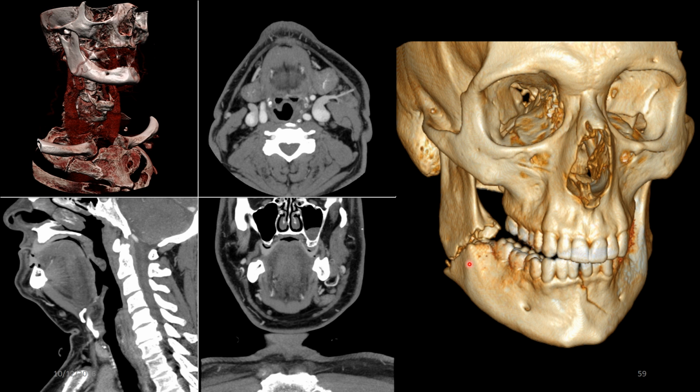And then usually when you fracture your mandible, it fractures in two places. So we've got a quite obvious fracture through there and a fracture that doesn't completely extend all the way through just here. These are just some CT scans of your neck. And then they've reconstructed these scans in the axial plane. That's not reconstructed. You've got the sagittal plane and the coronal plane. But I wouldn't worry about those too much just yet.